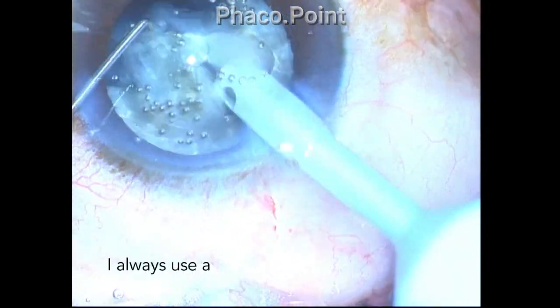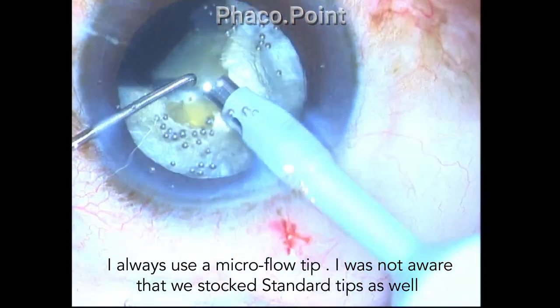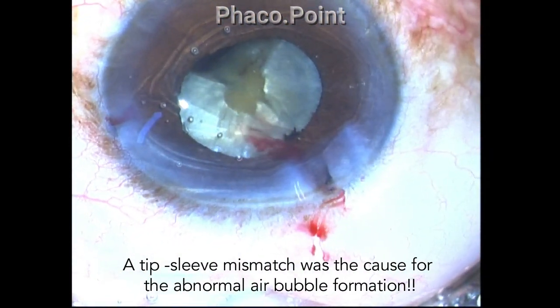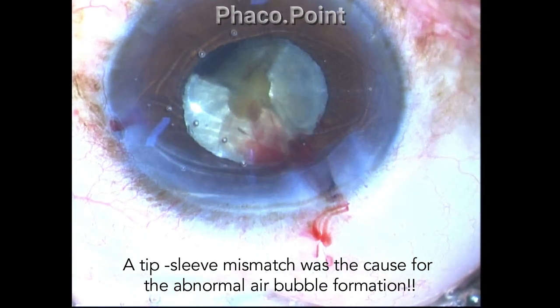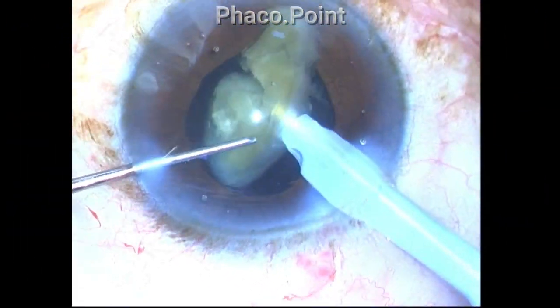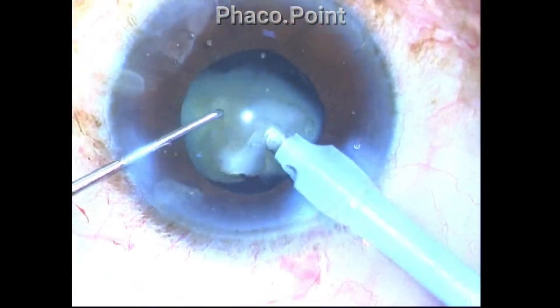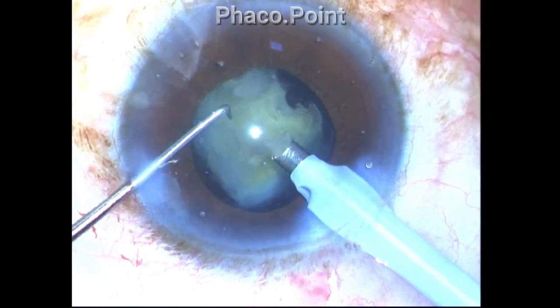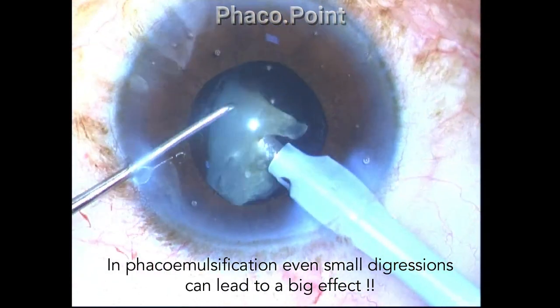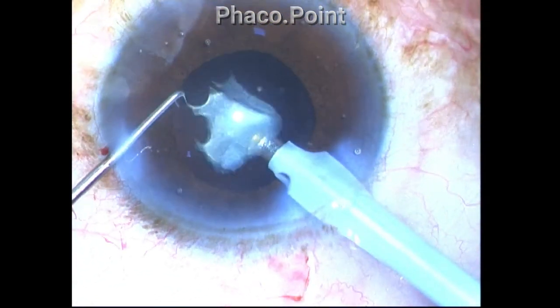So let's look at this again. I am now using a 20 gauge standard tip with a sleeve that is meant for a microflow tip, which is the reason why the chamber was collapsing. So once I changed the tip to a microflow tip and I used the appropriate sleeve, then everything started happening fine once again. So the lesson here is that the devil is in the details and we should use the appropriate tip with the appropriate sleeve.